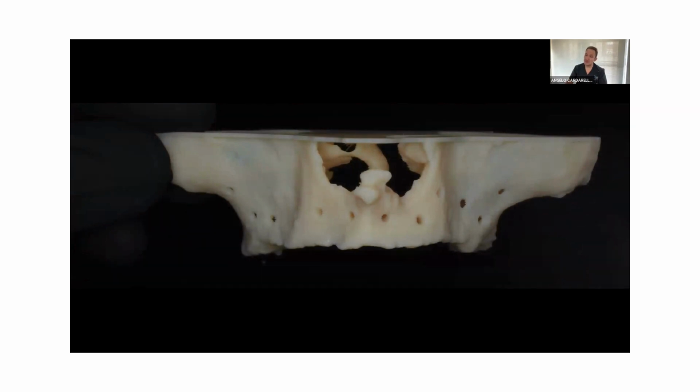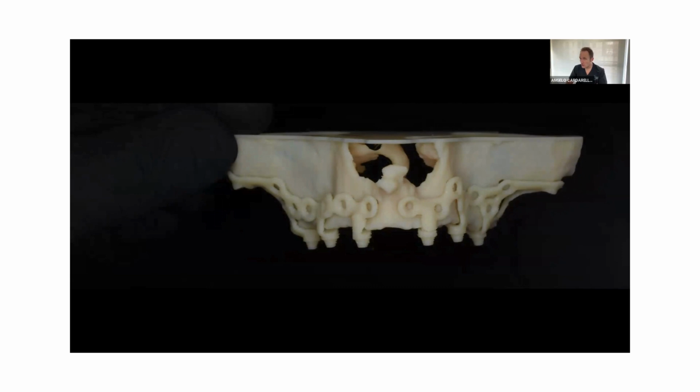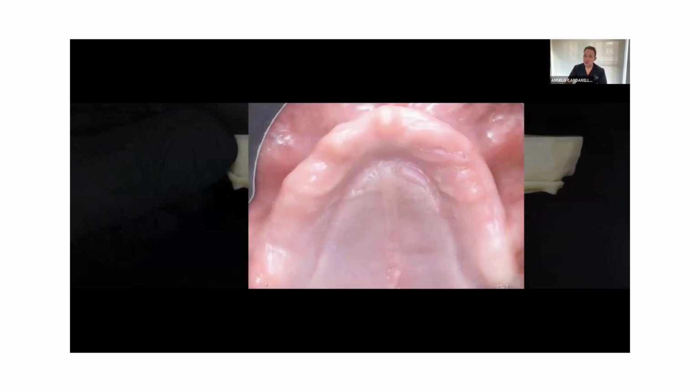Have a look at this patient. No bone in terms of height and in terms of thickness. So what can we do? We are planning to place 2 customized implants, not one piece, but 2 customized implants, as I told before, because I want to reduce the tension. Okay?